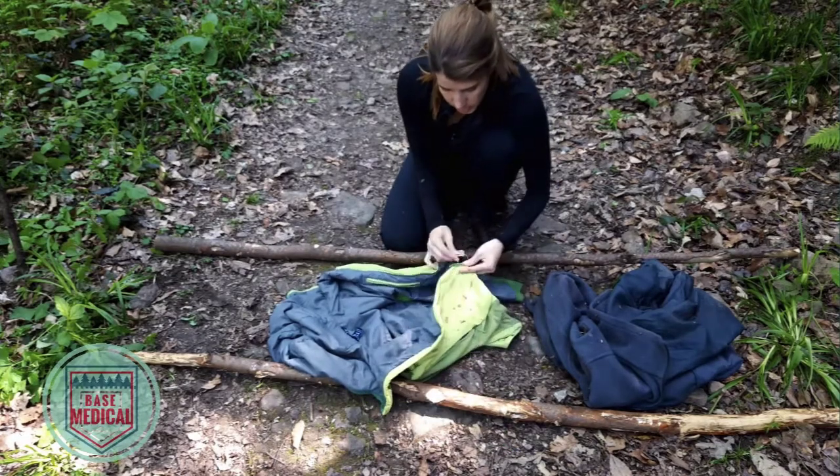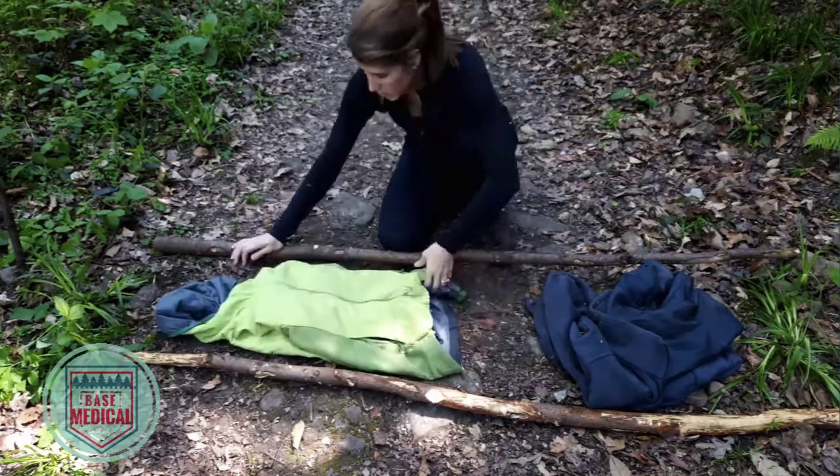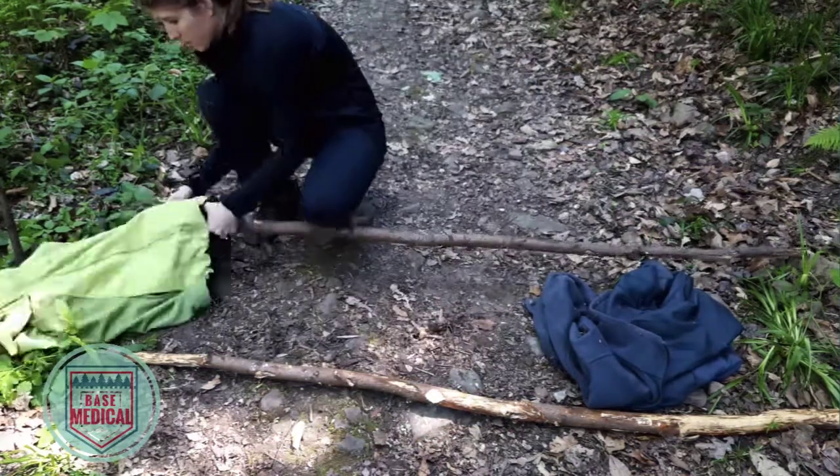Fully zip and invert the sleeves of at least two jackets — more may be used. Then thread poles or branches through the sleeves.